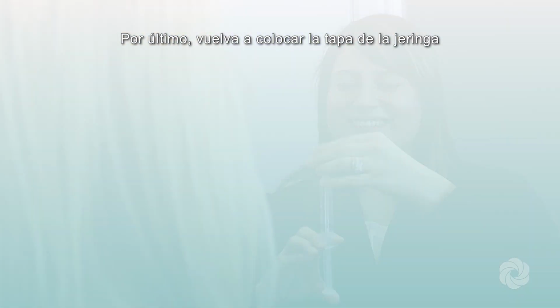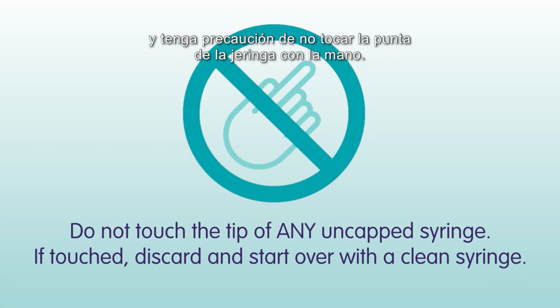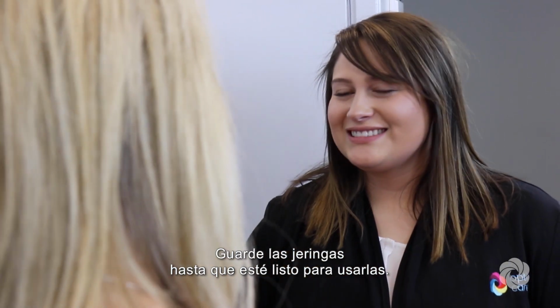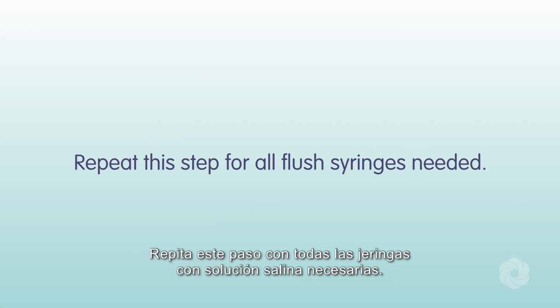Finally, replace the syringe cap, being careful not to touch the tip of the syringe with your hand. If you touch it, you will need to start over with a clean syringe. Set aside the syringes until you are ready to use them. Repeat this step for all flush syringes needed.